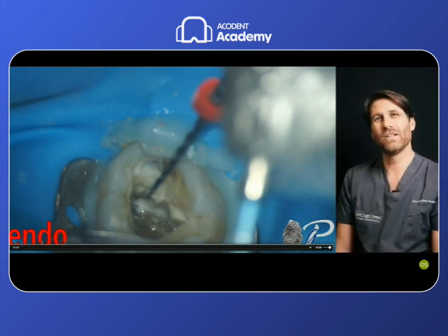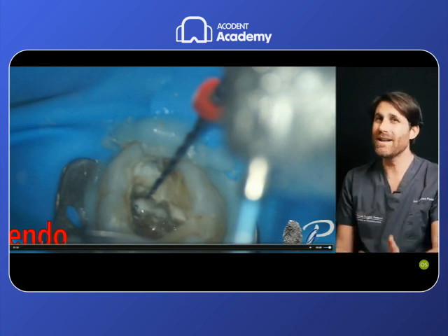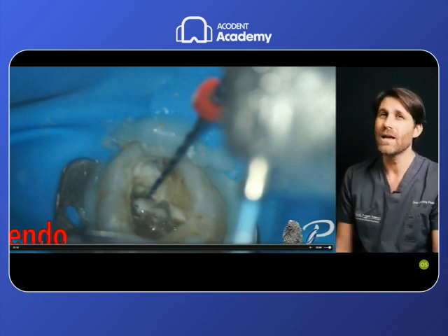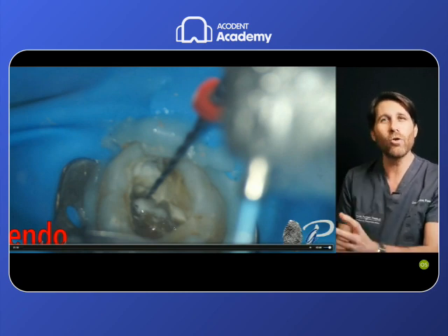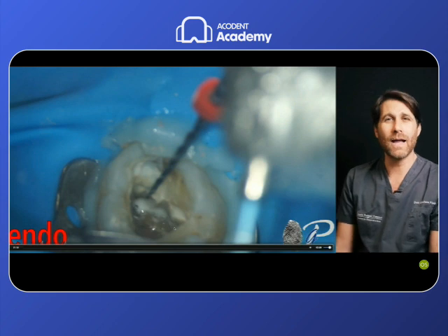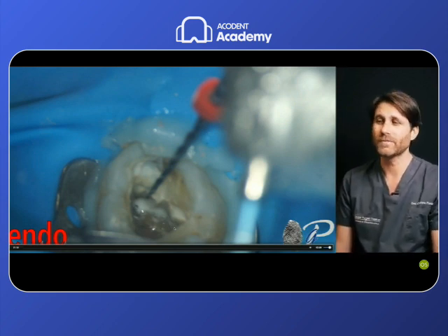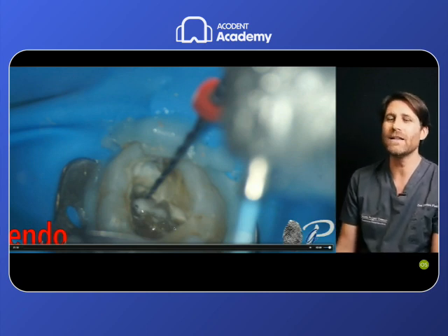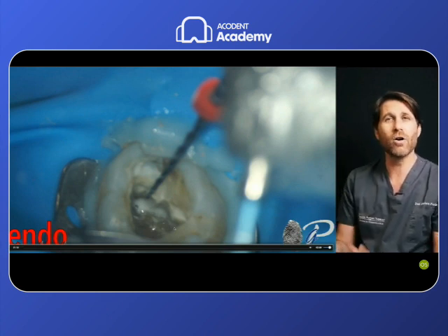The cutting efficiency of this file gives it the power to push a bit on the tip to penetrate and cut this dentin, and if the instrument cuts the dentin, then it follows the path of least resistance given by the root canal. So cutting dentin, it follows the original trajectory of the root canal during the instrumentation. And it has the flexibility to do it even in a curved canal, even in a very strong coronal curvature given by the anatomy of this root canal.